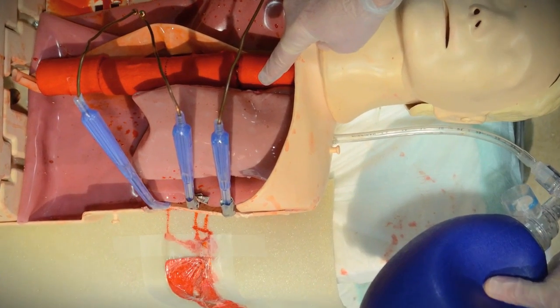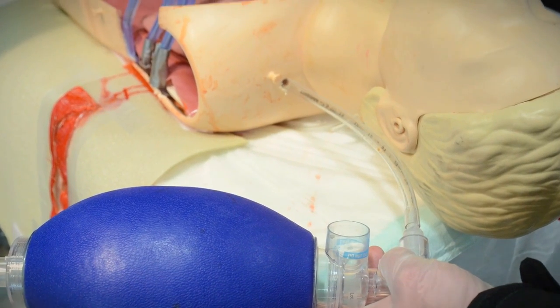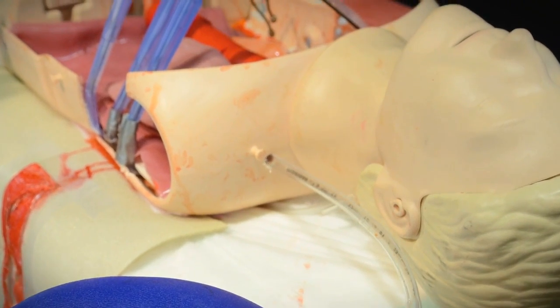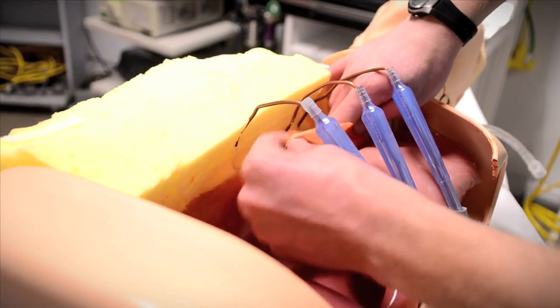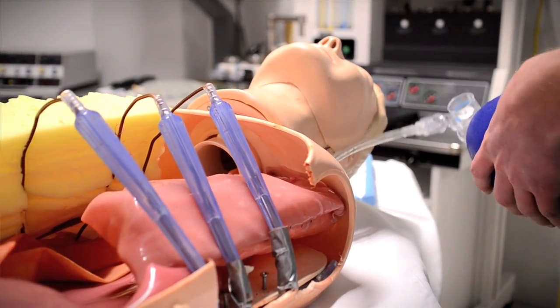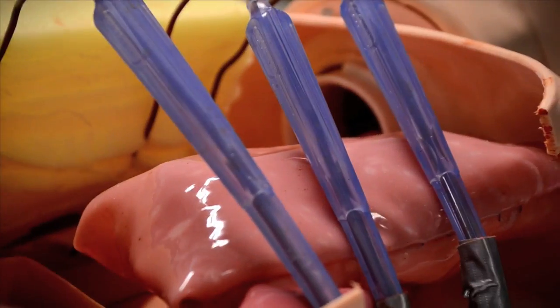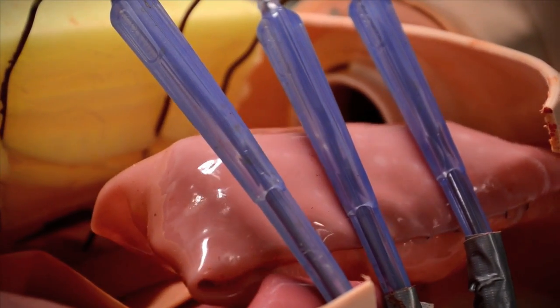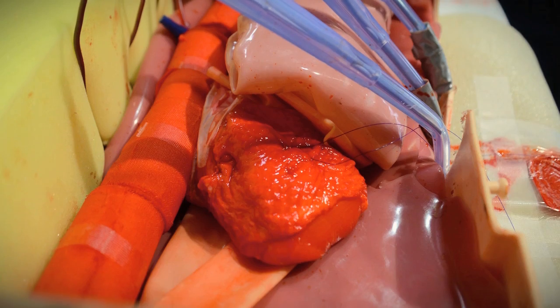To simulate the lung, we used a non-rebreather mask and an ET tube. I drilled a hole into the top of the CPR mannequin and inserted the ET tube through the hole, then attached an Ambu bag to the top of the ET tube. We wrapped the bag in some pink silicone, which made it appear more similar to lung tissue. When the participant opened the chest, we were ventilating the Ambu bag, creating what would hopefully look like a lung inhaling and exhaling.